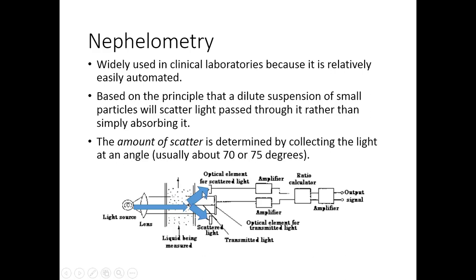So what nephelometry does is it measures the stuff that's scattered. Instead of measuring what passed straight through, the clear solution, which is essentially what we're looking at with turbidimetric testing, how much light passed through because it never hit a little object in there, nephelometry looks at how much light we scatter away because it did hit a small particle.